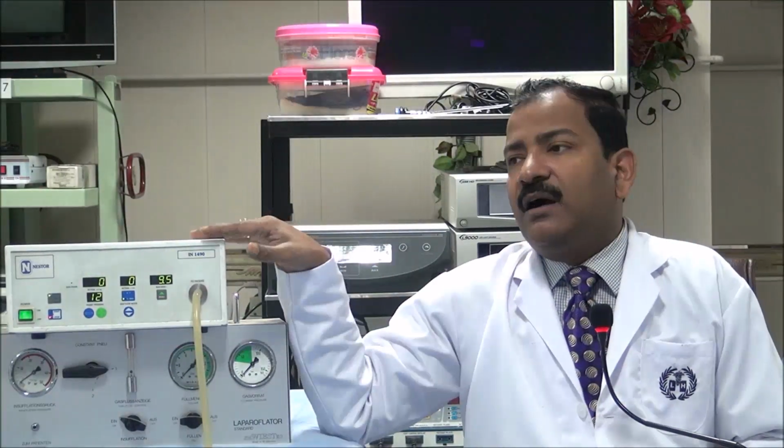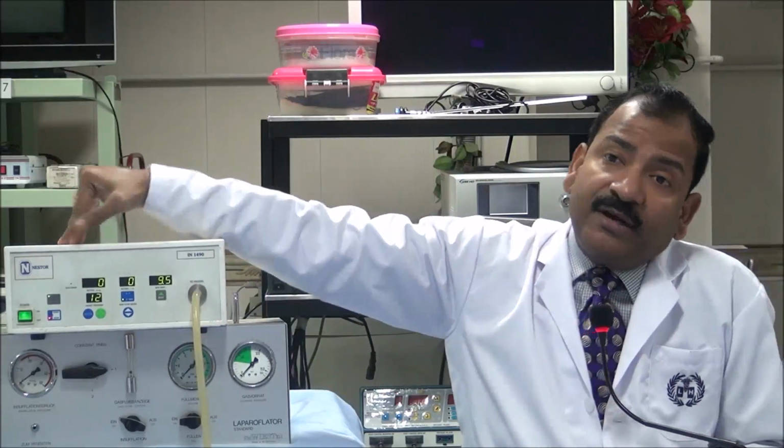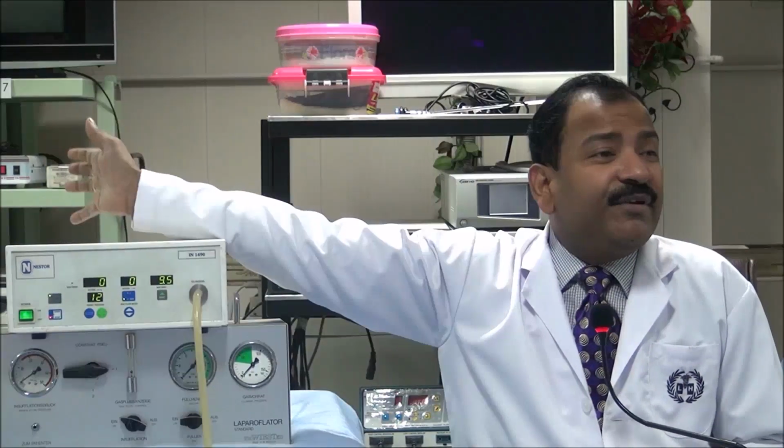Because at the end of the procedure it will be sacrificed anyway. It has to be sacrificed by law. It should not be left. Under anesthesia only, we give a little more anesthesia and it will be sacrificed. Otherwise it will be in pain once it recovers. This is called euthanasia, meaning that under anesthesia only it should be the end of the life. So we are using air, because a CO2 environment everywhere is not good.